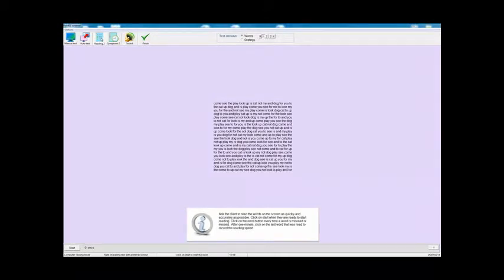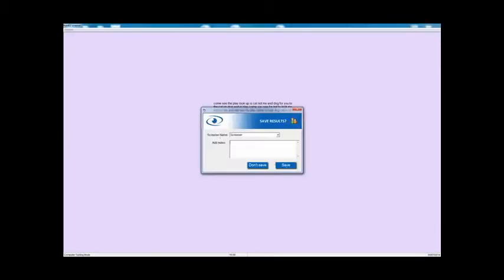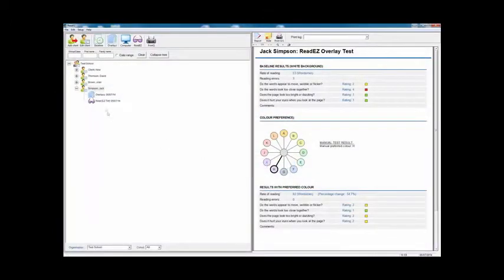Having determined the optimum color, once again you do the rate of reading test, this time with the whole screen colored. You'd normally record for a minute, but I'm stopping the clock there. Then you repeat the symptoms again with the whole screen colored. Click on finish, enter any other comments, and save it. You'll see that we've got the ReadEasy tint and the preferred color was H. You may well find that the preferred color for a tint is slightly different to the overlay — that's because the whole visual field is tinted, not just a part of it. Once again you can see the percentage change in the rate of reading compared with the baseline.